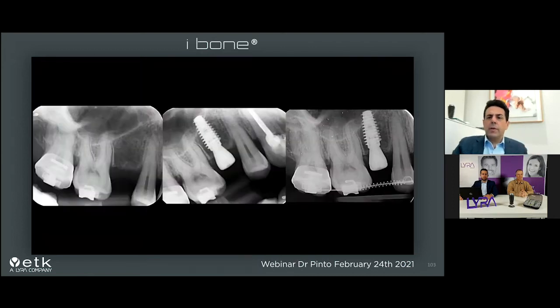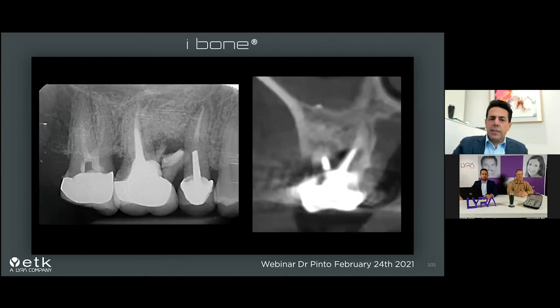And we can repeat this kind of surgery many times in this situation. Let's look at this one, where we can combine the post-extraction and sinus elevation. For evident reasons, we decided to remove these teeth and put an implant in immediately. The patient is flying, but not at the moment. She's not flying enough because she's a pilot.